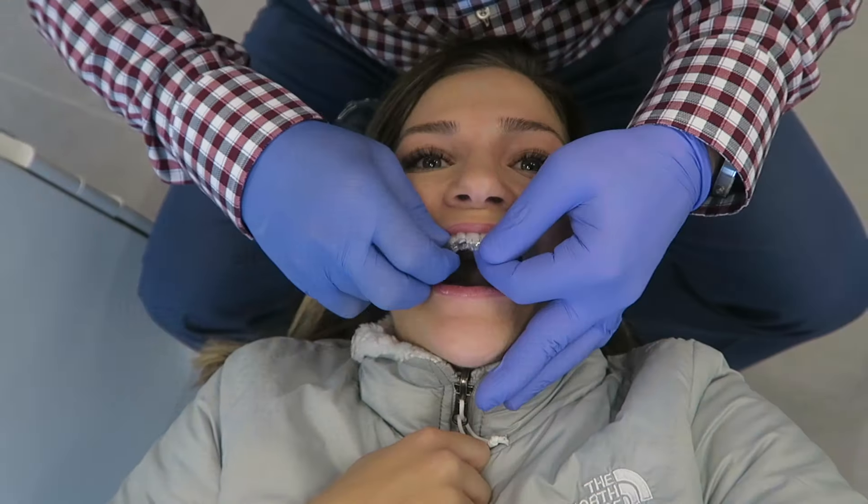The first week is the most challenging to get used to. Your teeth will become very sore upon putting your first set of aligners in. It may also take some getting used to when it comes to putting in the aligners. This is totally normal. I remember when I first had mine it took me anywhere between two and five minutes just to take them in and out.